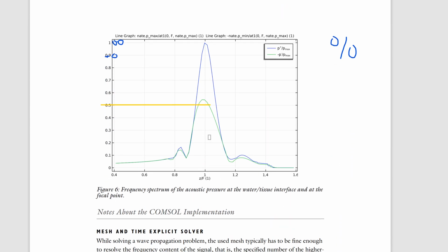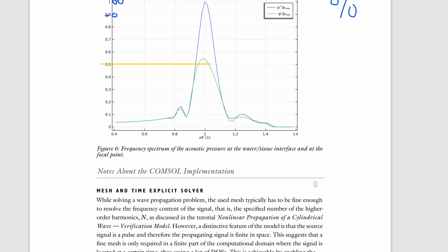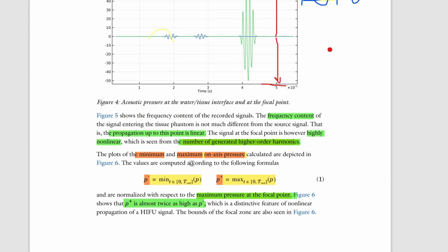Well, some way that says as we move some ways away from our focal point. Could be in time. Could be in distance. But this is our peak. I'm thinking if this was distance, this would have to be our boundary, but these lobes look very similar, so these may just be side lobes. Okay, let's get past that and continue.